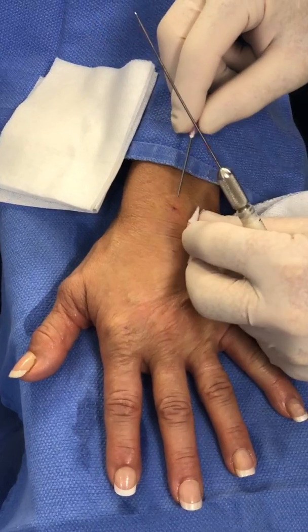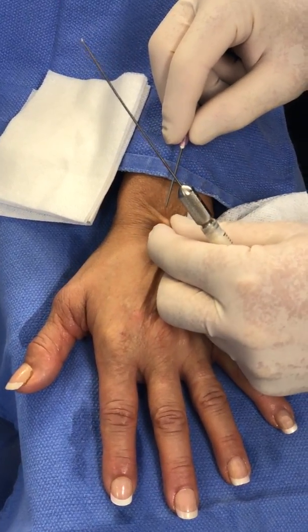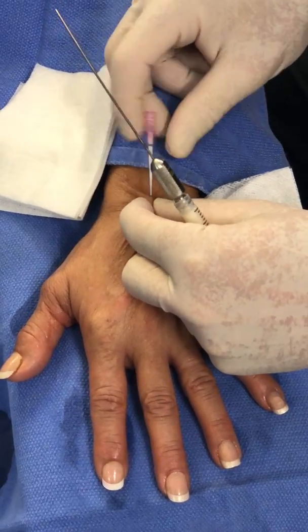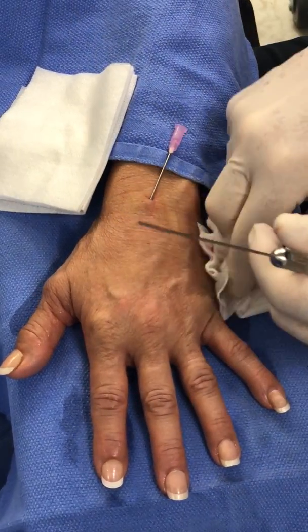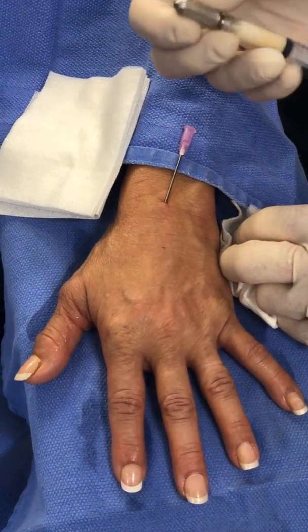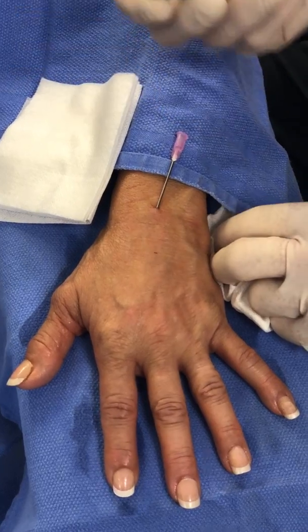I've injected marcaine and xylocaine with epinephrine here, and we just take an 18-gauge needle and make a little puncture wound there. And then this is a 19-gauge sterile blunt cannula.